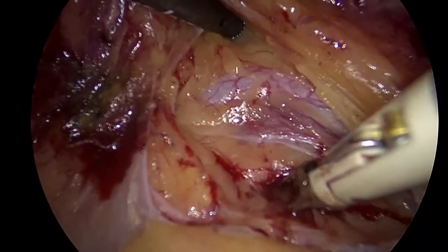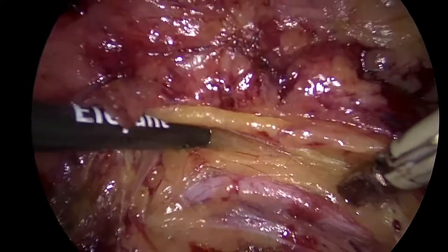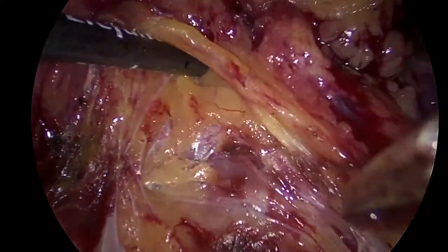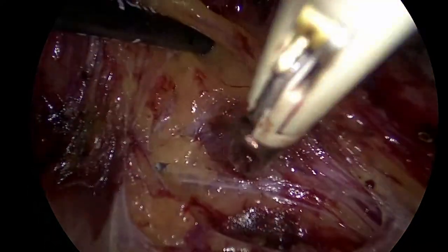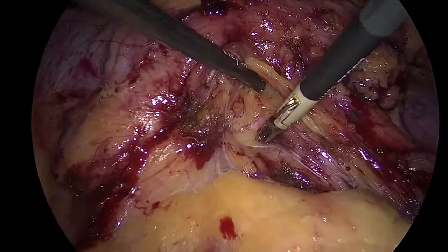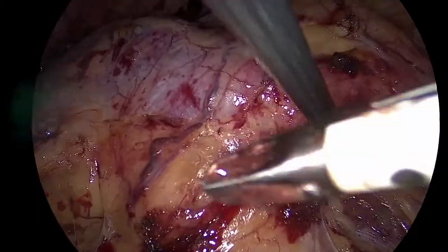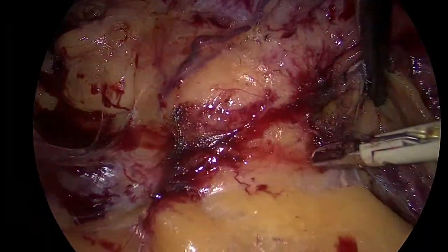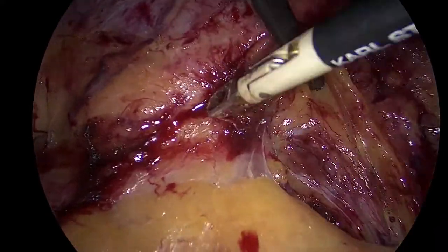So normally, you would say that you see the spermatic first and then the ureter. But what you do here is you lift up the whole thing. That's why you see the ureter. Very important. Why do I need to see the ureter? Because sometimes you need to see the level of your dissection. Show me the upper pole. Centralize the kidney. Show me the upper pole. So look, sometimes if you have done the dissection here, you get the tendency to go very deep. Look where my ureter is. I can stay further up. So it's very important to see your ureter at this point.